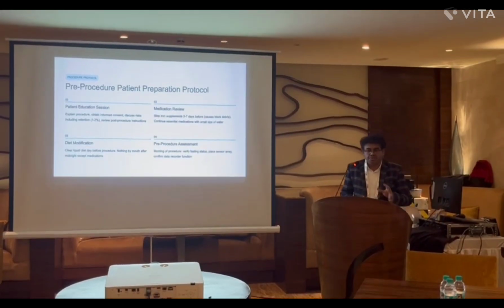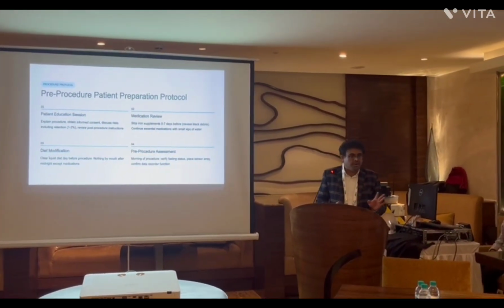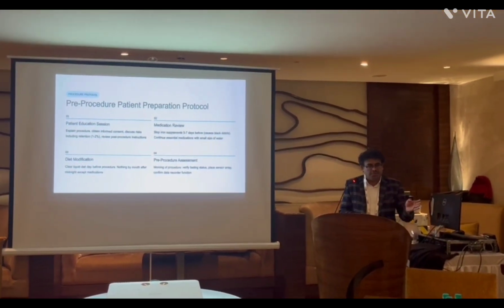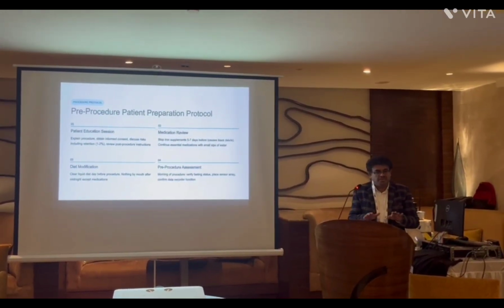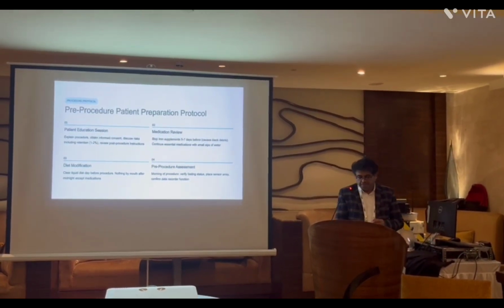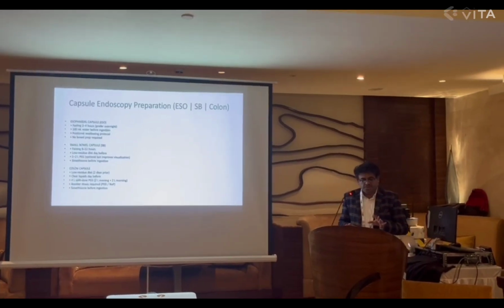For the esophageal capsule, the patient should be fasting at least 2 to 4 hours. In some patients we can apply 4 to 6 hours also. And for the esophageal capsule, as I already discussed, various positional changes need to be looked into. Within 4 hours everything will be complete and we can get back. Within 30 minutes, most of the time, the battery life will go down with the esophageal capsule. But what about the preparation? The main thing is fasting 2 to 4 hours for the esophageal capsule.